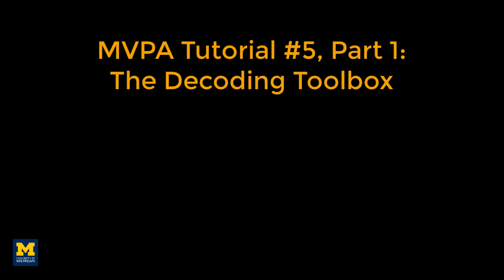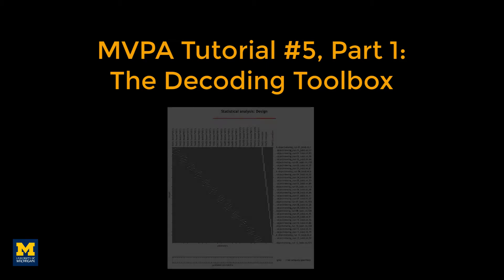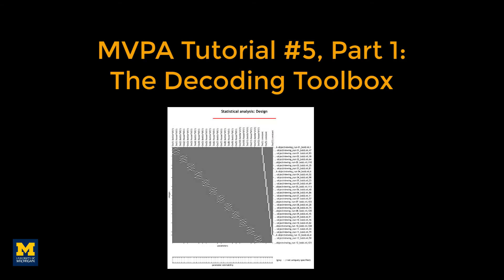Having generated beta maps for this subject — one per condition for each run — we are now ready to run a multivariate pattern analysis, using the beta maps as both training and testing data.